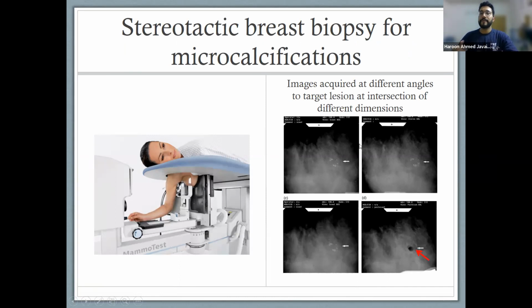What's the good thing about mammograms is that it covers the whole breast. So if there is microcalcification spread throughout, you can see the whole breast clearly on the mammogram. Versus on the ultrasound, you're probably going to see it only in one fixed location, depending on how you move the probe and all of that.